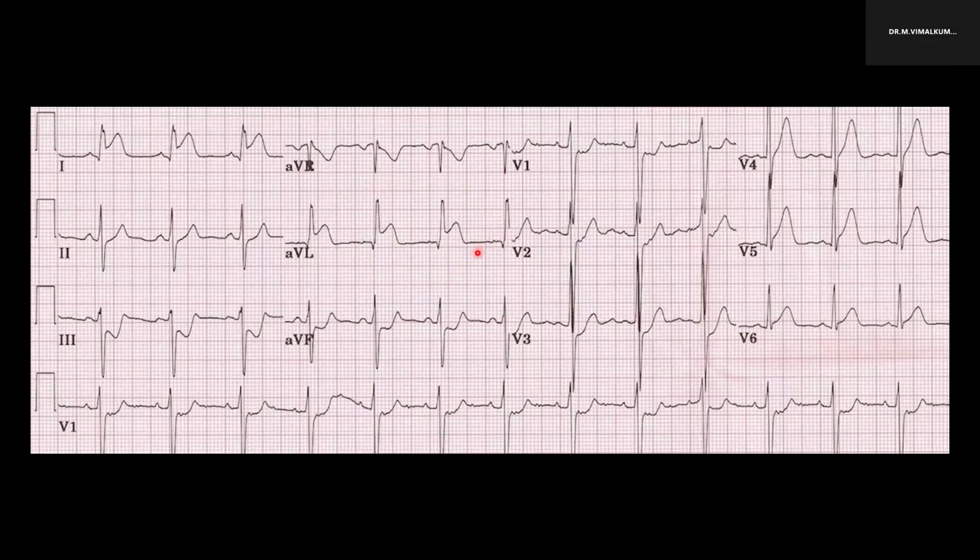Thrombolysis. Very good. Fibrinolytic. Because the ST elevation is due to a red thrombus, rich in fibrin, you have to dissolve the clot by giving fibrinolytic therapy. Right? Good. Probably left circumflex. It's probably high lateral. Lead 1 and AVL represent the high lateral leads, probably supplied by the left circumflex artery. Excellent. Super.